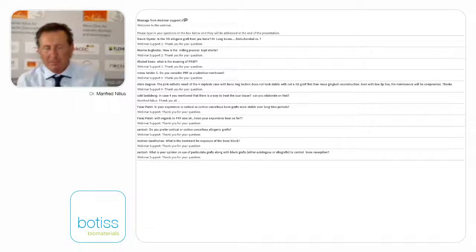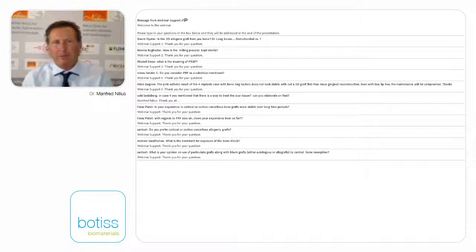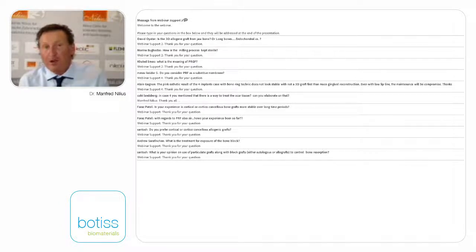When there is super exposed bone, remove it. Let the soft tissue grow on the bone, and when you make a new approach for implantation, you can see is there enough bone or is there not enough bone, and then you have to decide, make a second augmentation. So do not compromise the bone, be gentle to the bone, remove it, otherwise you have an actinomyces infection and you will lose a big block.